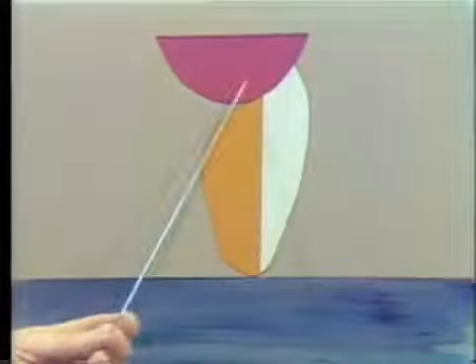This diagram shows a labial-lingual section through a maxillary anterior pontic in which the Steele's flatback facing has been utilized. It shows the relationship between the porcelain here, the gold here, and the soft tissue of the alveolus here. This lingual contour, of course, has been developed by waxing onto the precious metal backing and then investing and casting that backing on to give the correct lingual contour.